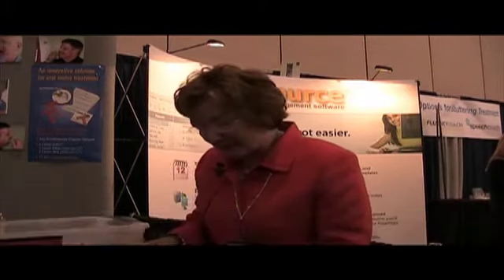Welcome to ASHA 2010 and welcome to Chewy Tubes. I'm Mary Schiavone, the inventor of the Chewy Tubes and the author of the jaw rehabilitation program.